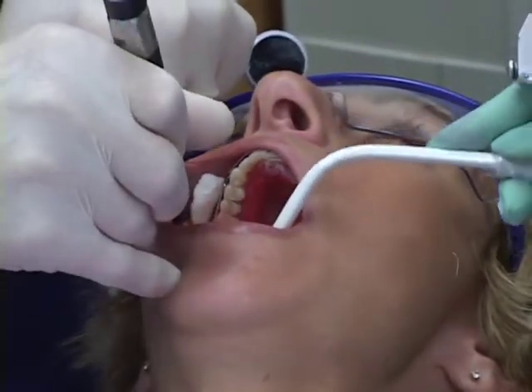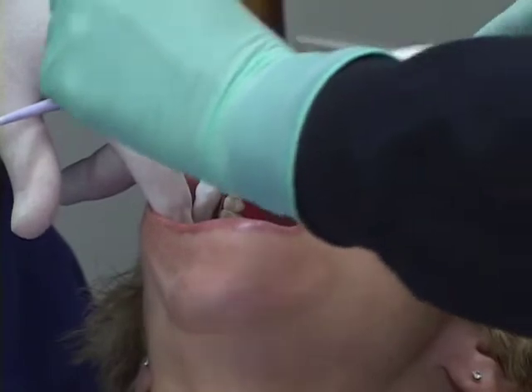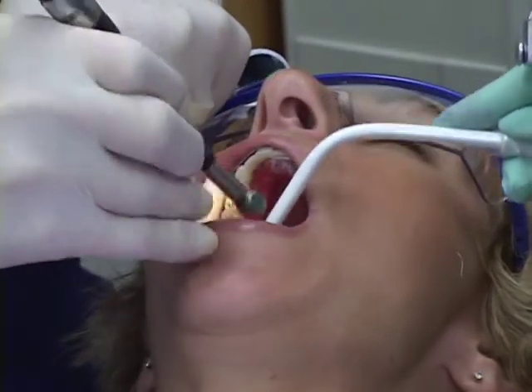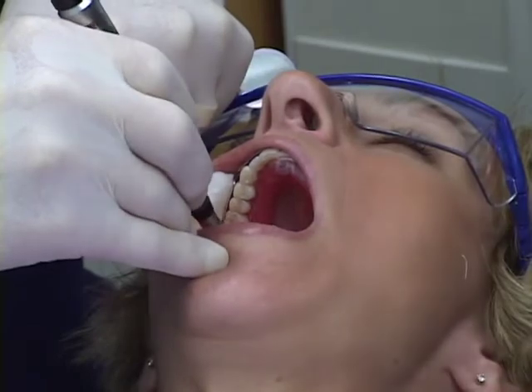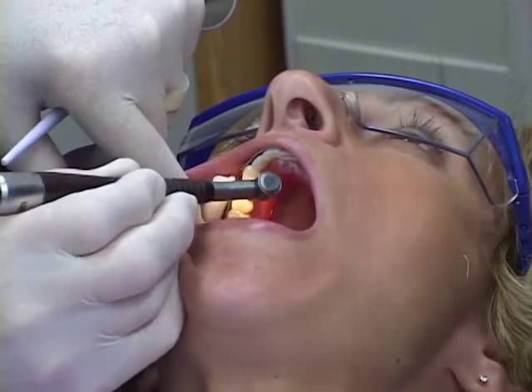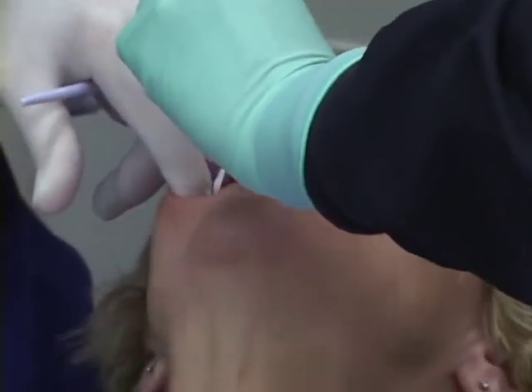Just because we're getting a little marked up here with some extraneous marks, let's change the red here. And occasionally I'll change colors. Instead of cleaning the teeth up, I'll just change colors. Chop. Again, red film. Okay. Look at that. Chop. Open.